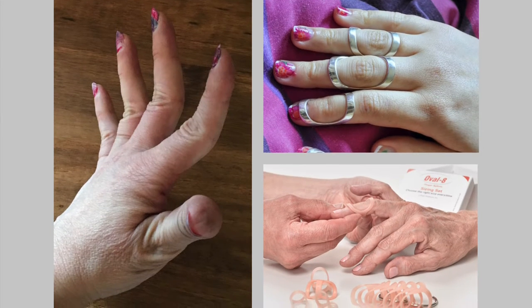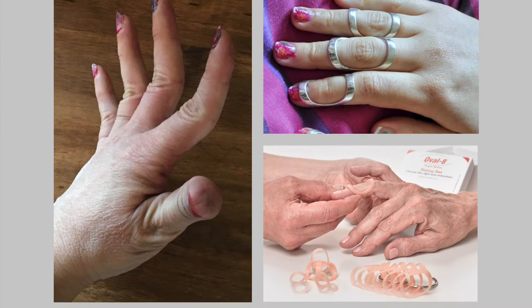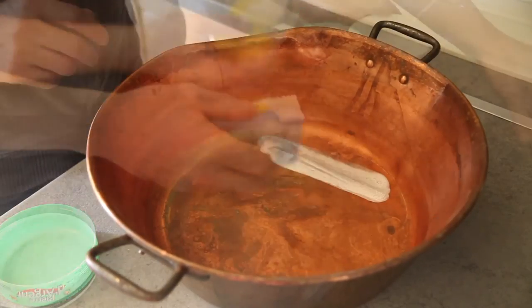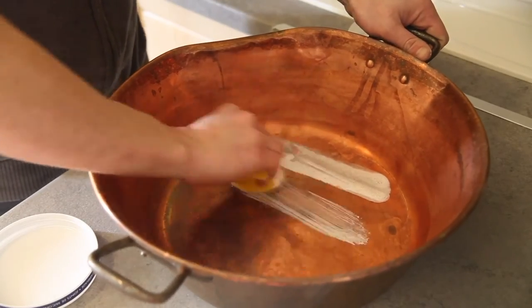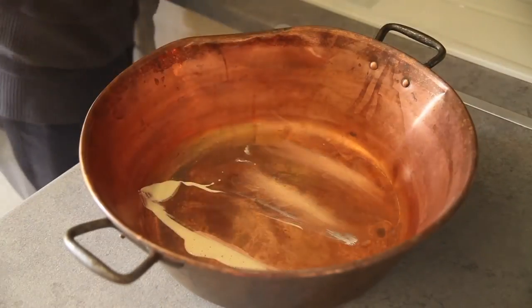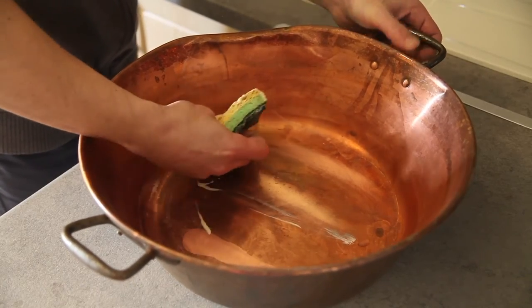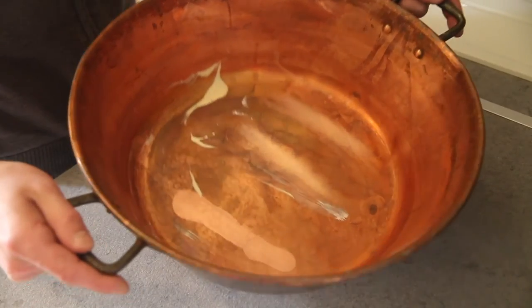Sometimes, our Nina reported redness at her fingertips and fatigue and pain in her finger joints as a result of overgripping during strenuous and repetitive tasks. We hypothesized that providing visual feedback correlated to finger flexion and force will enable individuals with hypermobility to modify their behavior to reduce discomfort.